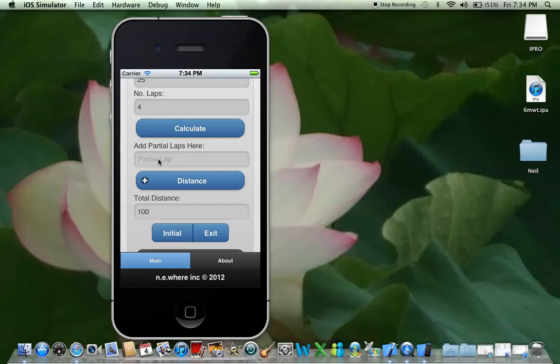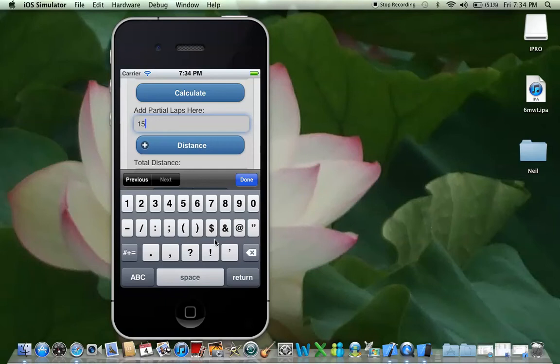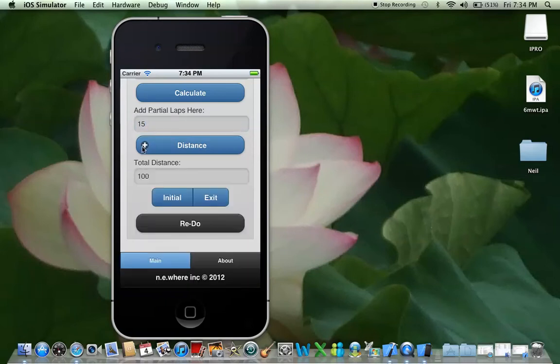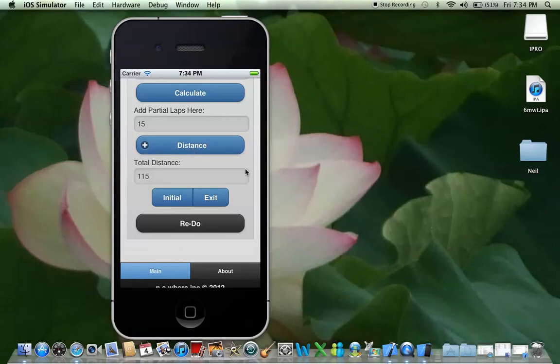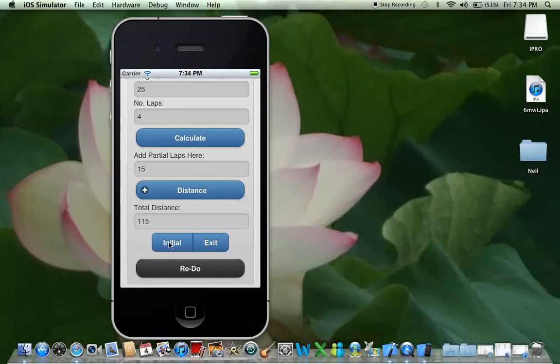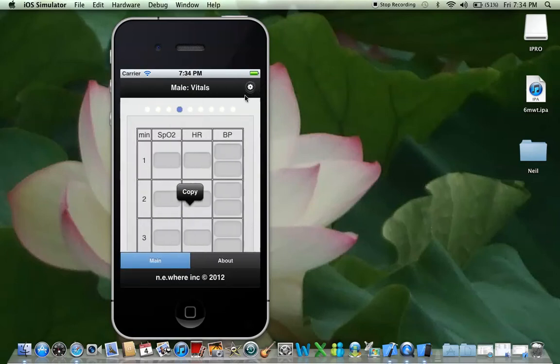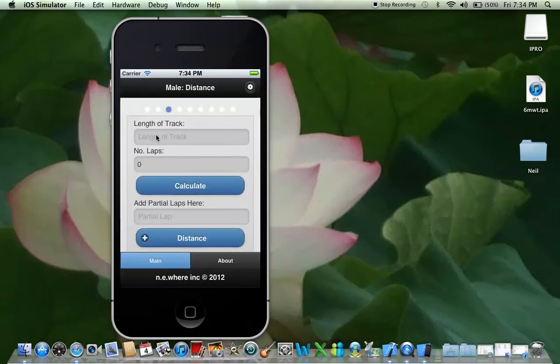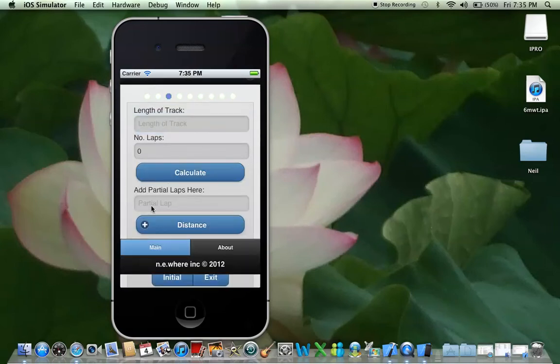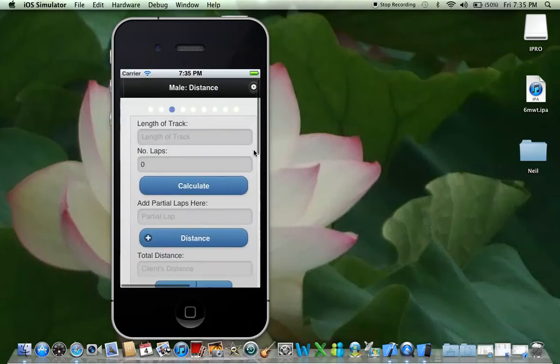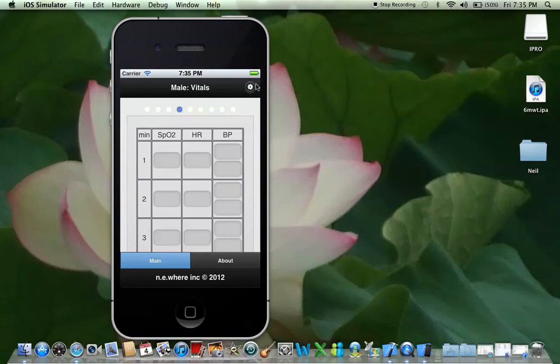You can also press the partial lap here. If they stop in the middle of your track and they only do 15 meters out of however many meters your track is, use the plus button to add that distance and it'll add onto the total. Then you'd add that to the initial assessment, so you now have your vital signs, your predicted distance, and your client's distance. You're probably swiping between this page, the next page, and also the timer while doing the 6-Minute Walk Test, but you can pre-fill in the length of track.